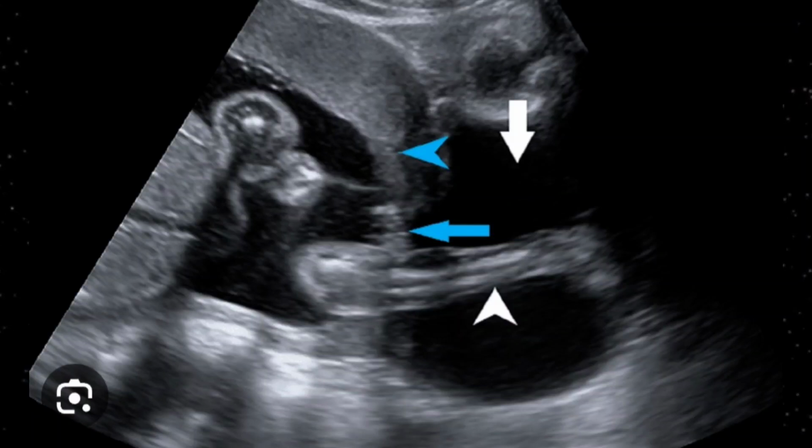Fluid has already come out, so abortion is evident. You cannot control this abortion any longer, because one of the limbs is already out, so some other part will definitely be out in a period of time. So it needs immediate attention.